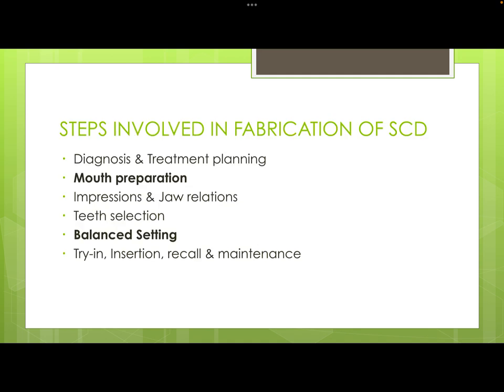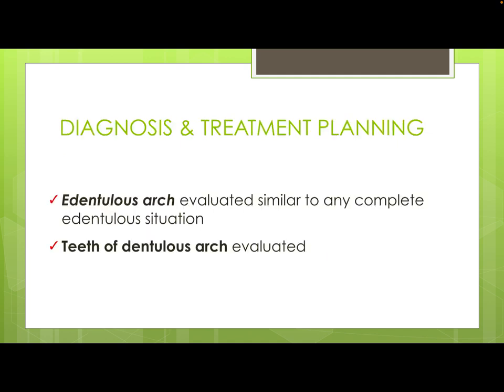A maxillary single complete denture opposing the lower natural teeth is a more frequent occurrence. The steps involved in the fabrication of a single complete denture are diagnosis and treatment planning, mouth preparation, impressions and jaw relations, teeth selection, balanced setting, try-in, insertion, recall, and maintenance.